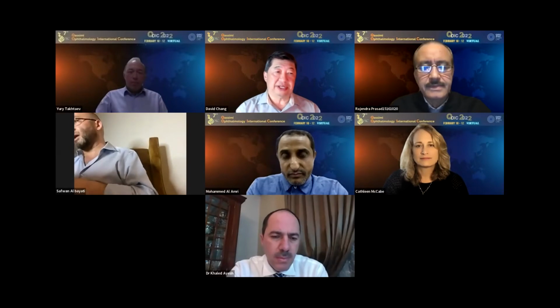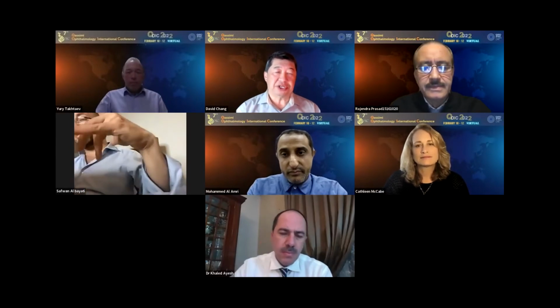Okay, Dr. David, for whom do you advise this technique can be done? I mean, is it something that anyone can use, or should learn it and know how to do it? Because I don't think that everyone can go ahead directly and do that. Sure. No, I think whether you're comfortable going through the pars plana, it's certainly within the skill set of all of us, because again, it's an anterior vitrectomy, and you don't need to put pars plana infusion in.